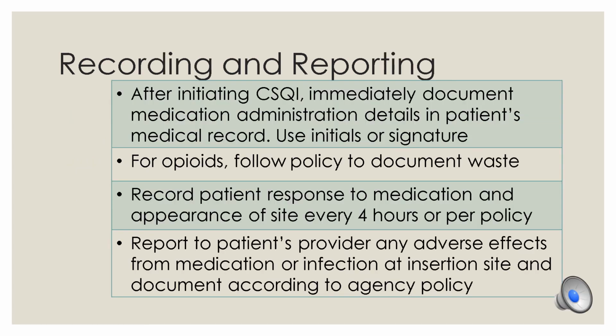After initiating the continuous subcutaneous infusion device, you want to immediately document the medication administered in the patient's MAR. If there's opioids that need discarded, you need to follow policy to document waste. You want to record the patient's response to the medication and appearance of the site every 4 hours so it's not being neglected. And you want to report to the patient's provider any adverse side effects. Sometimes if they are getting their insulin through this, they may have extremely high blood sugars, so they may need additional medical therapy for that.